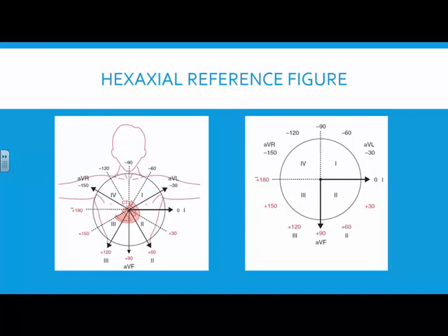So now, as it's going through the AV node, you have a little bit of what's called retrograde conduction, which means that it goes back just a little bit, which gives you your Q wave, which remember I said is usually pretty small, right? All right, so as it goes away from the positive briefly, it's going to be negative, right? All right, but then as boom, it starts coming down that bundle of His, and it's coming on towards the positive electrode, we're going to have our next positive deflection, which is your R wave, all right?